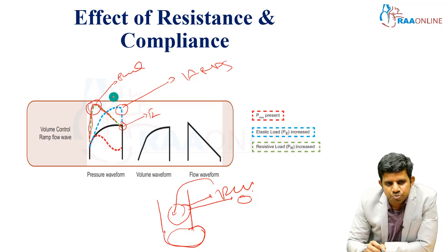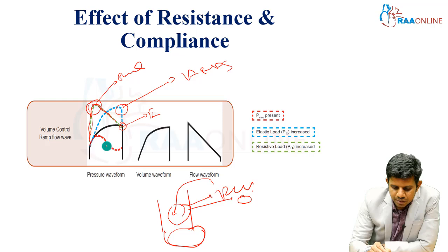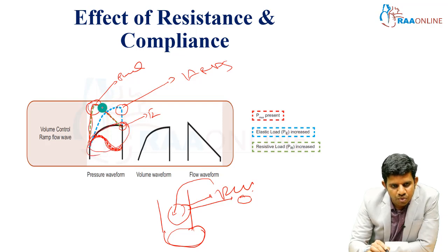If my patient takes a spontaneous breath, what happens? It gives a negative deflection. The pressure waveform shows an upward concave shape. So, if my patient is taking spontaneous breaths, the pressure time scalar is completely altered. We don't know whether the changes in this waveform are related to high resistance, low compliance, or just Pmus.